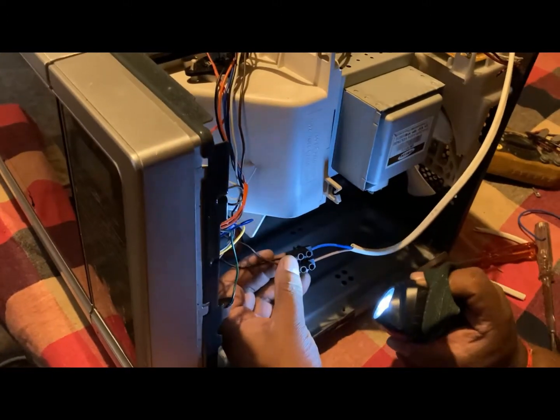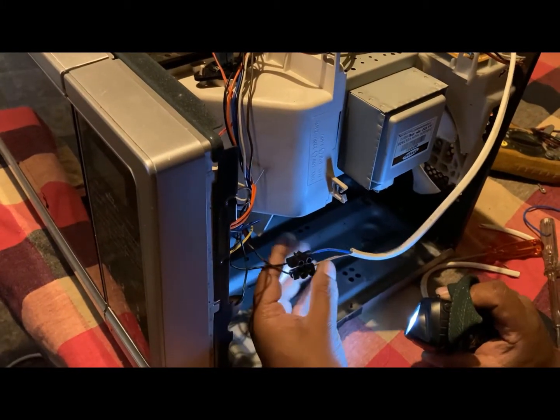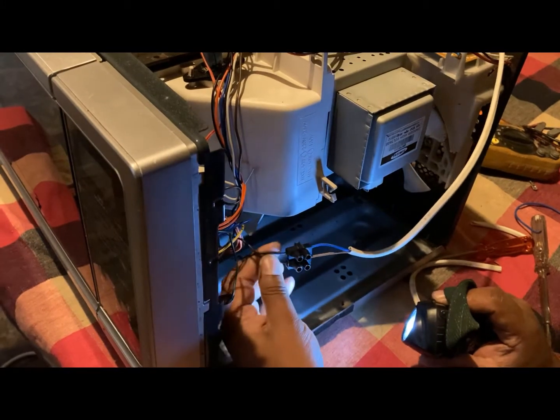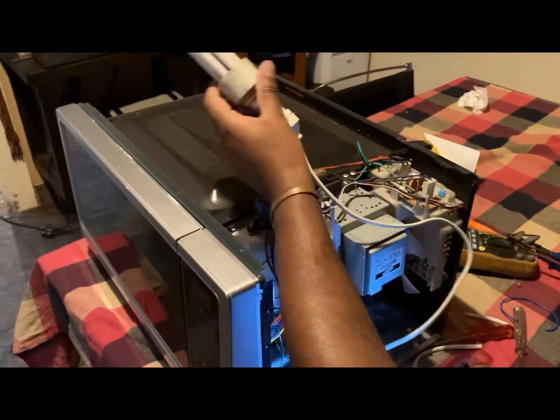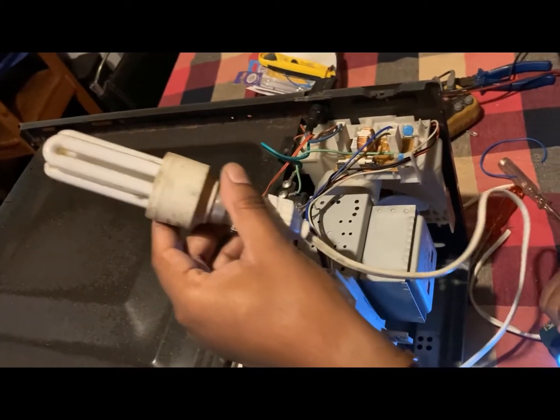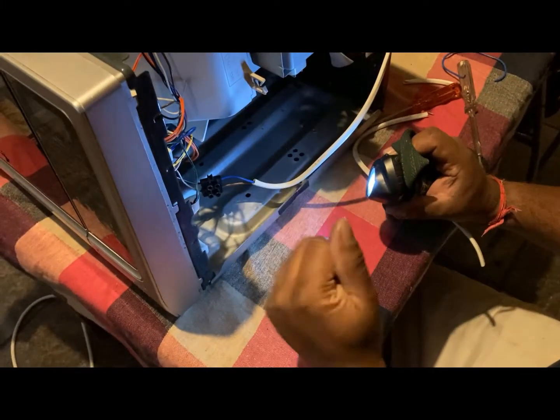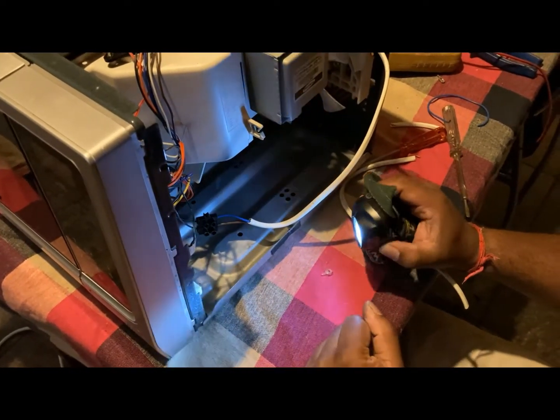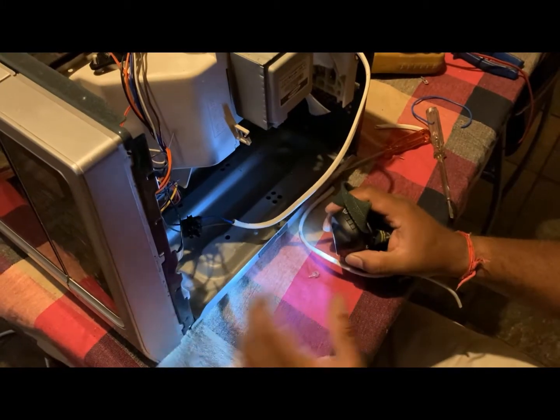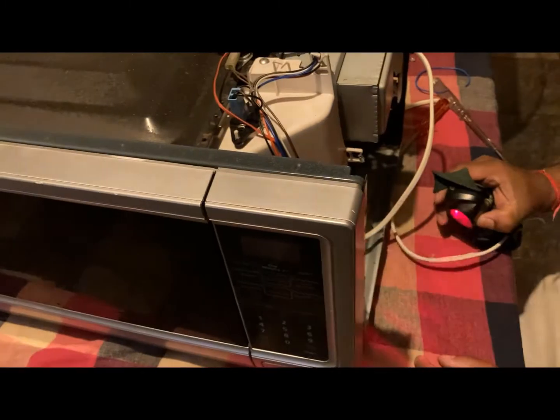So before I carry on, I want to see if it's really going to work. And I know it's going to work. So I just put a temporary lamp holder and a globe. But this is not the proper globe and lamp holder that I'm going to use. I'm going to use a UVC light inside. So I just want to test if it's going to work, but I know it's going to work. So I'm going to energize this microwave.